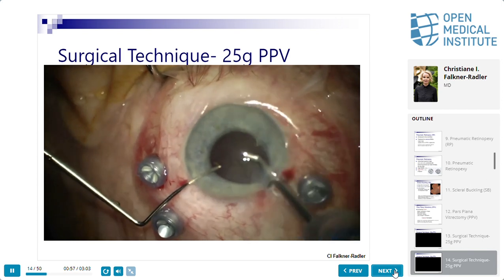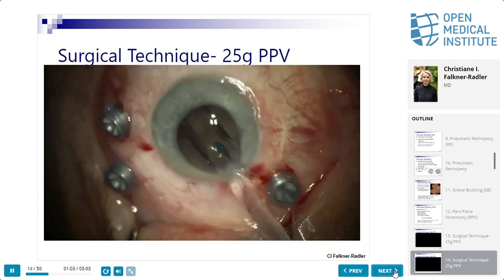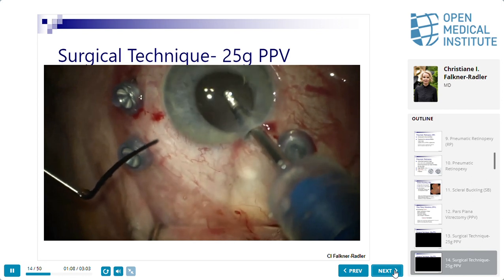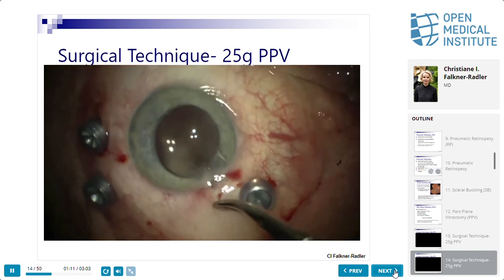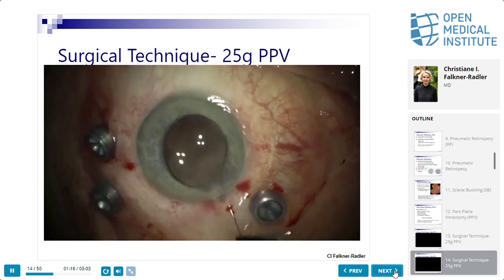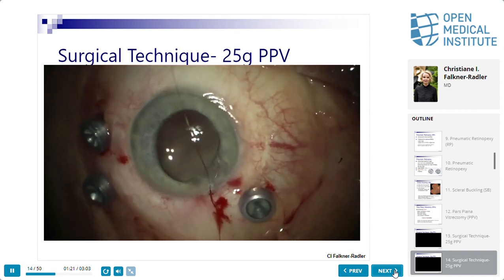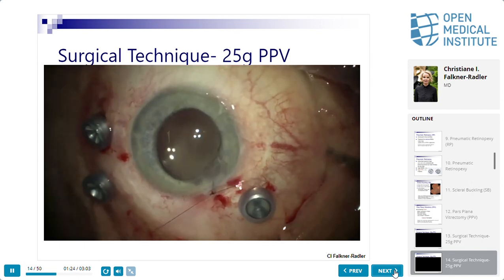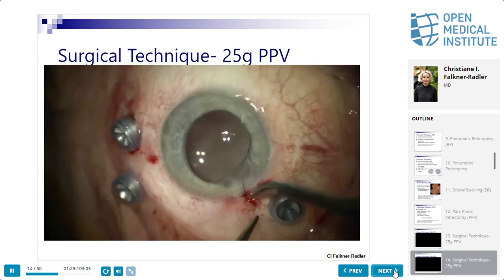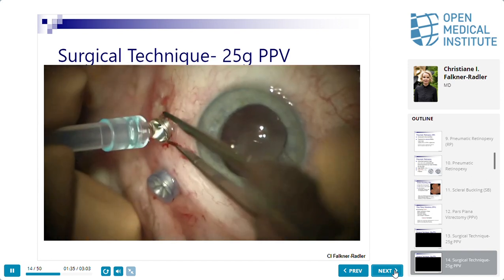You can use some devices to dilate the pupil again, but normally it helps not too much. But the surgery was okay, and I put in a different lens. It was from another firm. You see the blue haptics. It is from Polytech. It was also a preloaded intraocular lens. In this case, there's one difference, because here you see again my suture of the corneal incision, which I remove directly after surgery, not some days later.